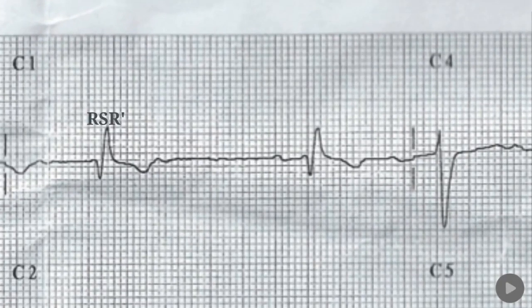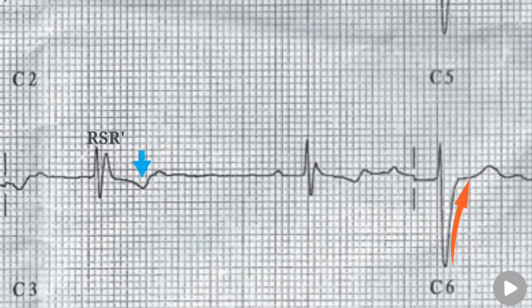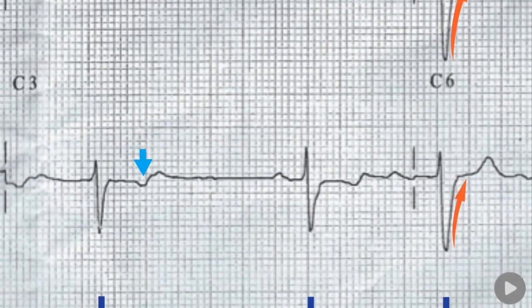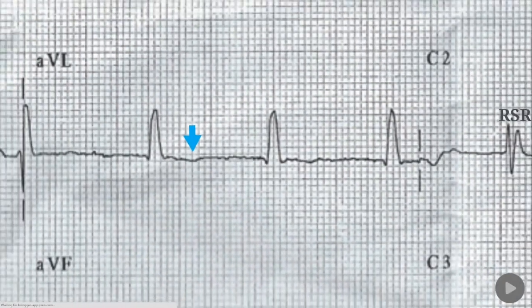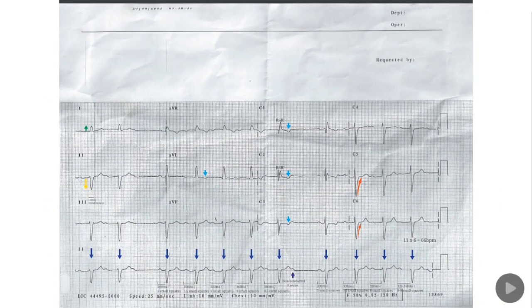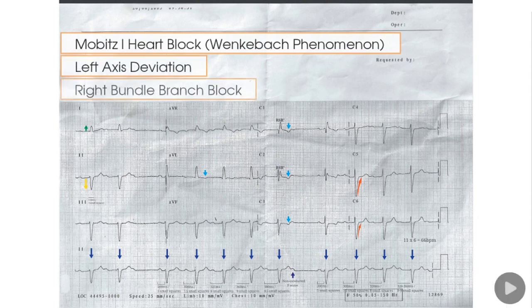This ECG is also showing T-wave inversion in V1, V2, and V3, and also in AVL. So in summary, this ECG is showing second-degree heart block, Mobitz type 1 or Wenckebach phenomenon, with left axis deviation and right bundle branch block.